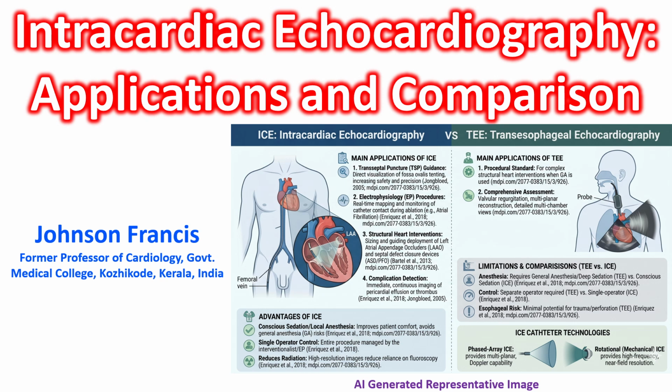Intracardiac echocardiography is a highly specialized invasive ultrasound modality that provides real-time high-resolution imaging from inside the heart chambers. While transesophageal echocardiography has long been the standard for guiding structural and electrophysiology procedures, intracardiac echocardiography has increasingly become the preferred choice in modern cath labs and electrophysiology suites due to its direct visualization capabilities and patient comfort.